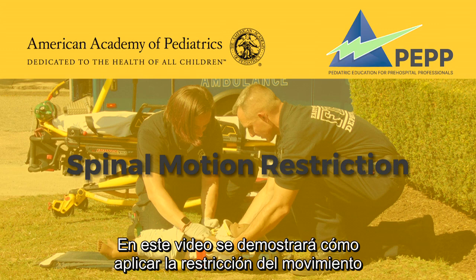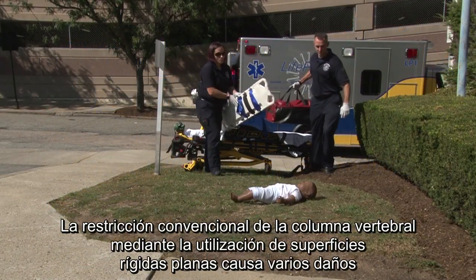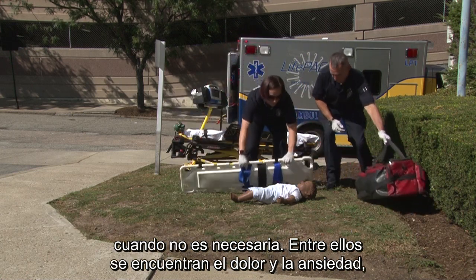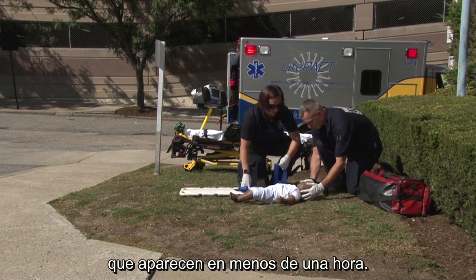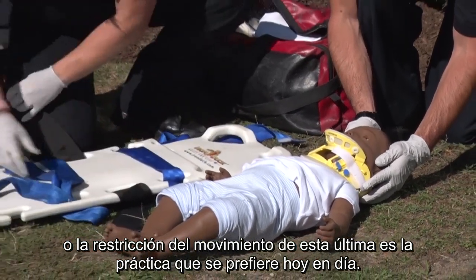This video will demonstrate how to implement spinal motion restriction for pediatric patients. Conventional spinal immobilization using flat, rigid surfaces causes several harms when it is not necessary. These include pain and anxiety, restriction of breathing, and development of pressure sores, which begin in less than 1 hour. Therefore, spinal protection or spinal motion restriction is the current preferred practice.